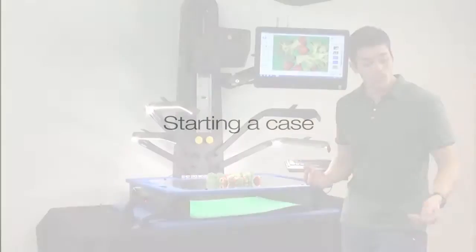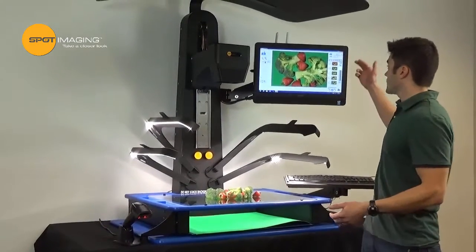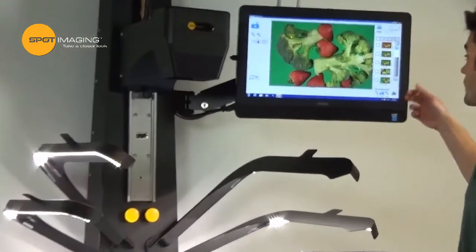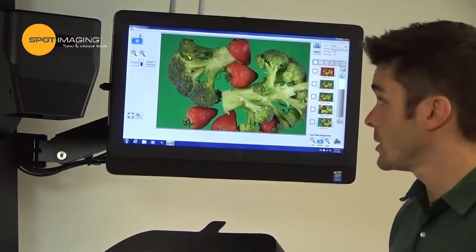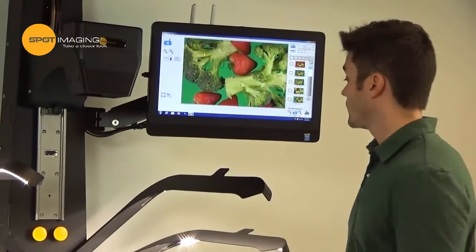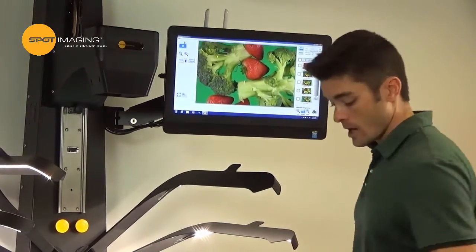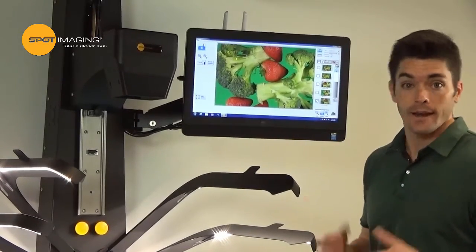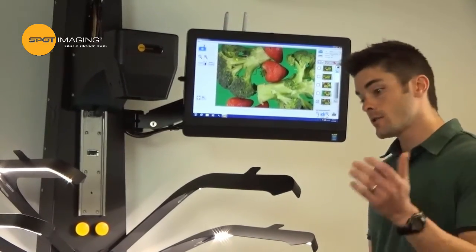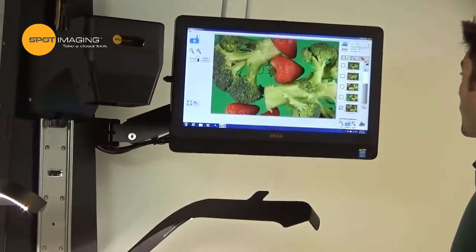To start a case you simply scan in your case number, and this brings up any previous images you might have from that case into our film strip. To capture an image you simply zoom into your desired field of view, reposition as needed with our adjustable boards, and capture an image with the foot switch. We can configure the software to stay in capture mode so you can take a series of images and annotate later, or you can go right into our annotation menu.